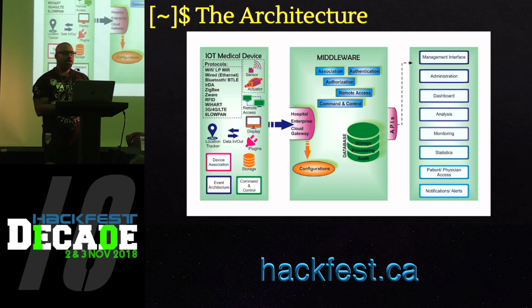So device manufacturers can access that data to see how the device is behaving in different scenarios and then better the device using that data. It can be used by security researchers across the globe, can be used by your doctors to take preventive measures based on your condition, and so on and so forth.